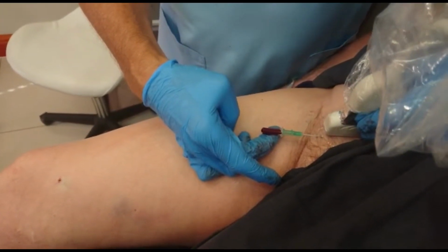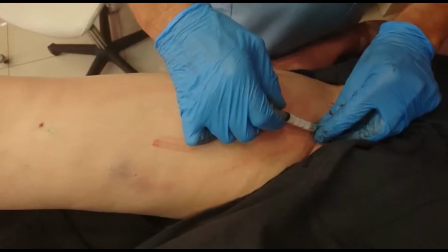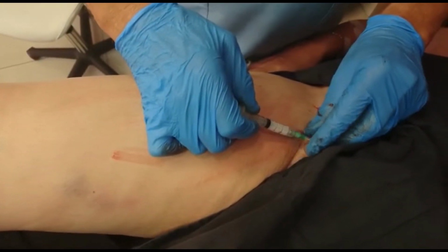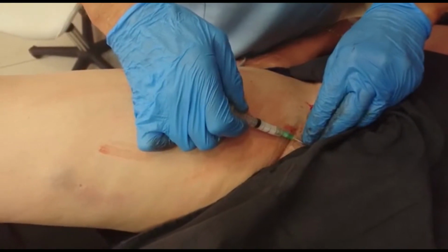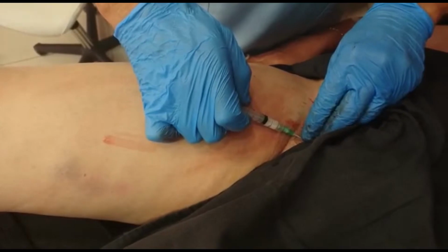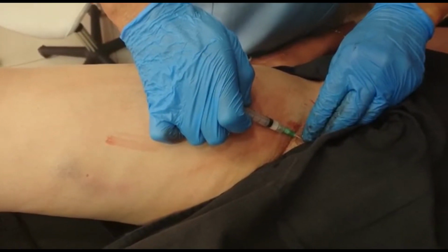We're now going to introduce a sclerosant with the patient in Trendelenburg. We know that we are in the vessel, and I'm just feeling the tip to make sure that I don't have any extravasation, which makes it a little awkward to use the probe at this time. And we introduce our foam into the area.